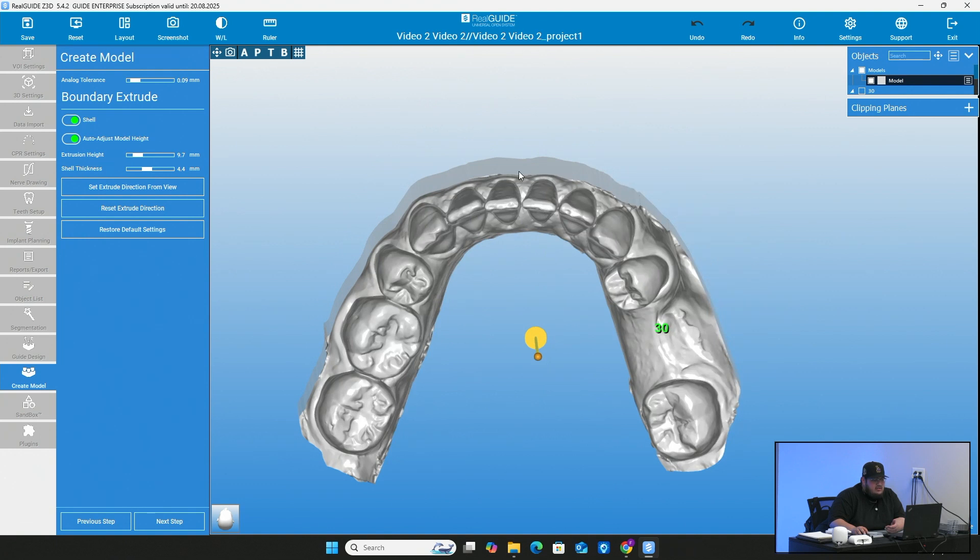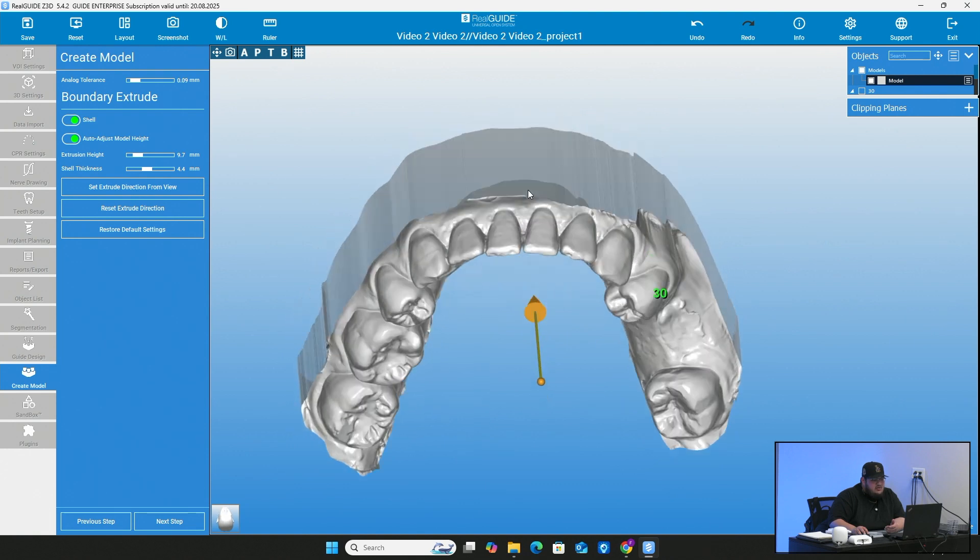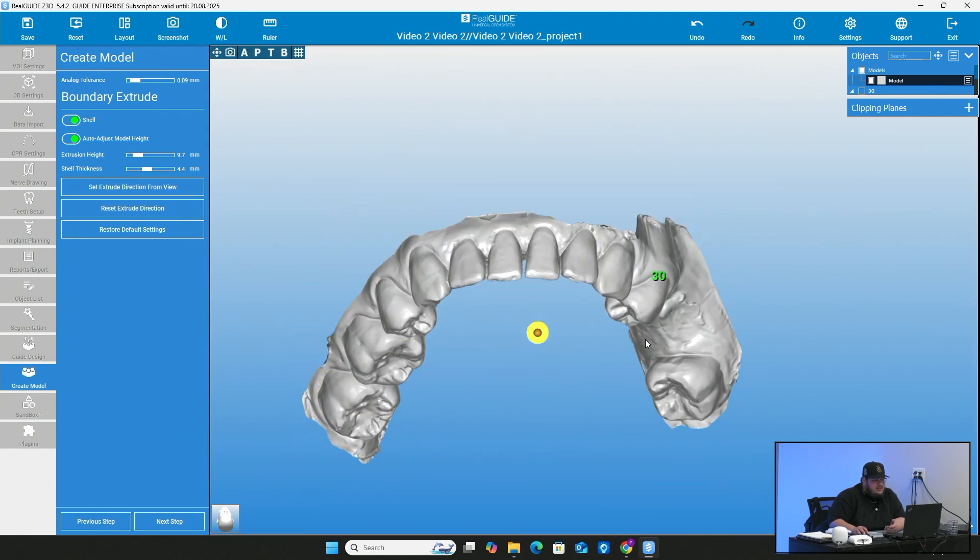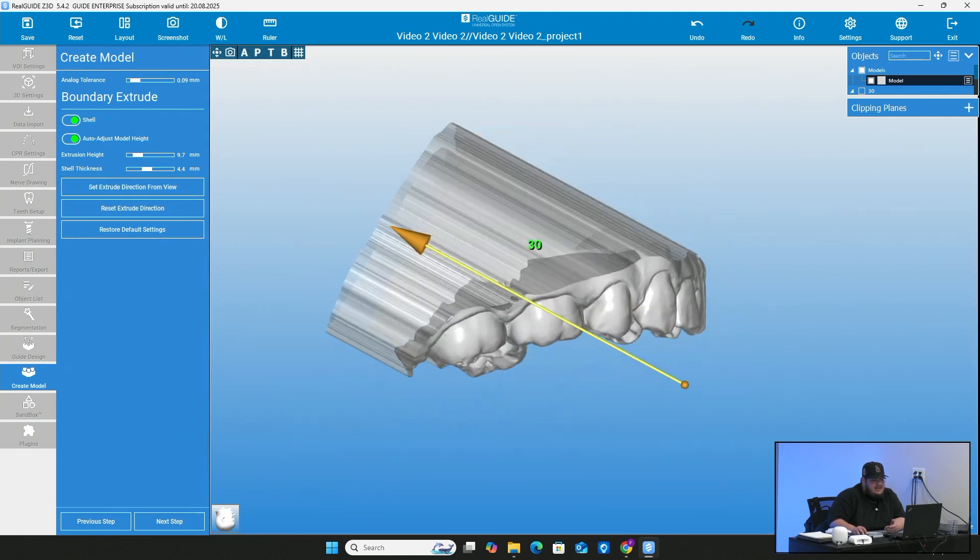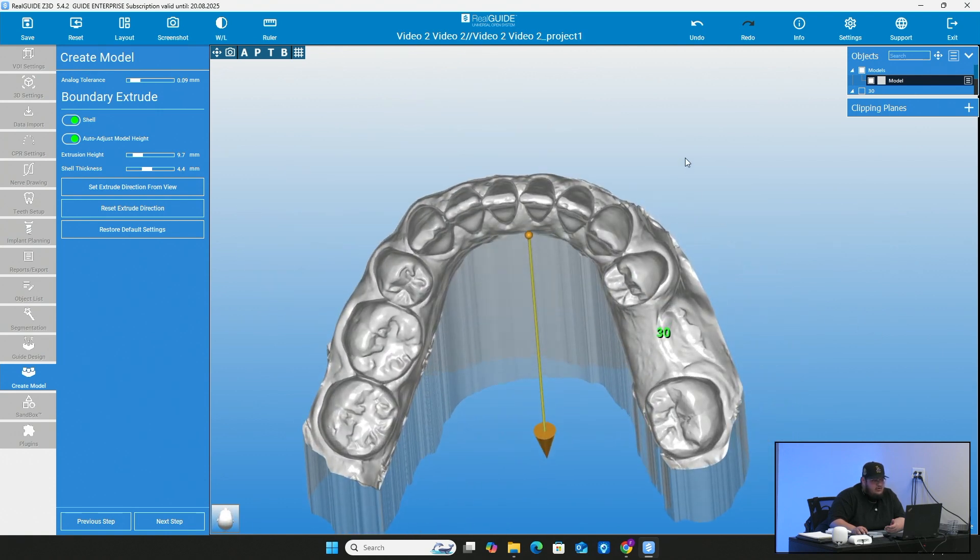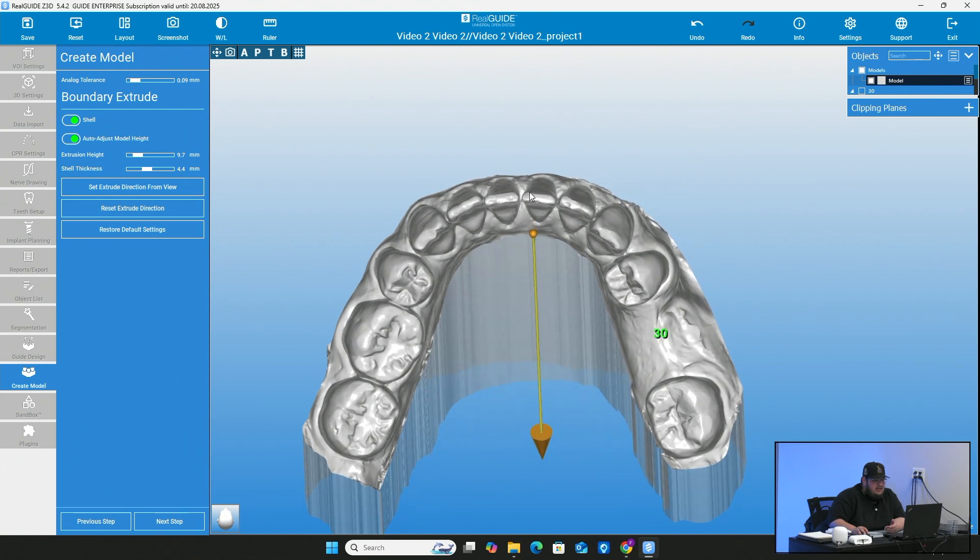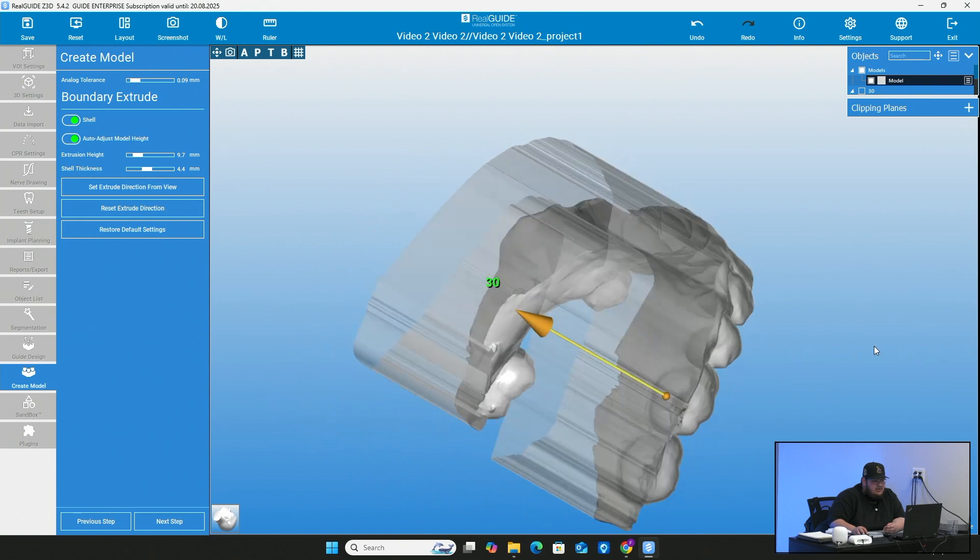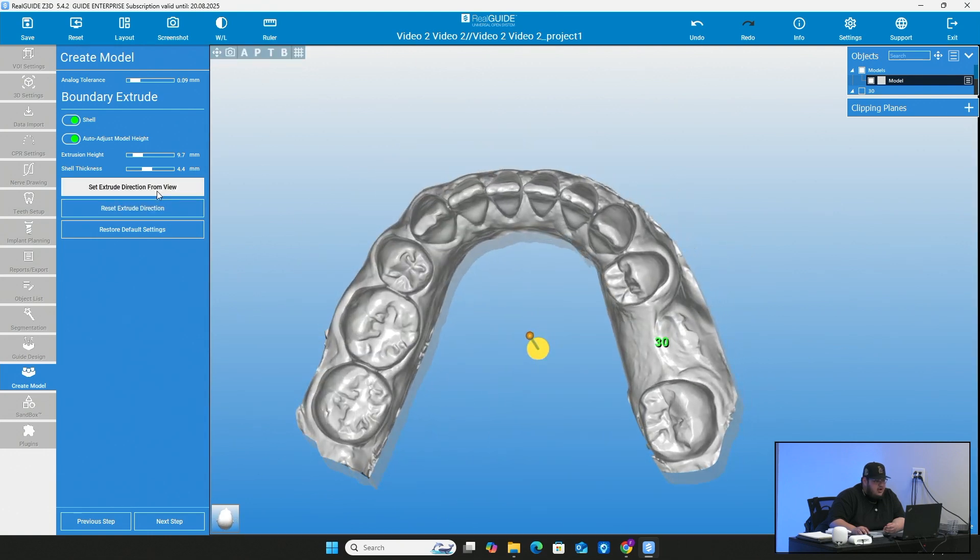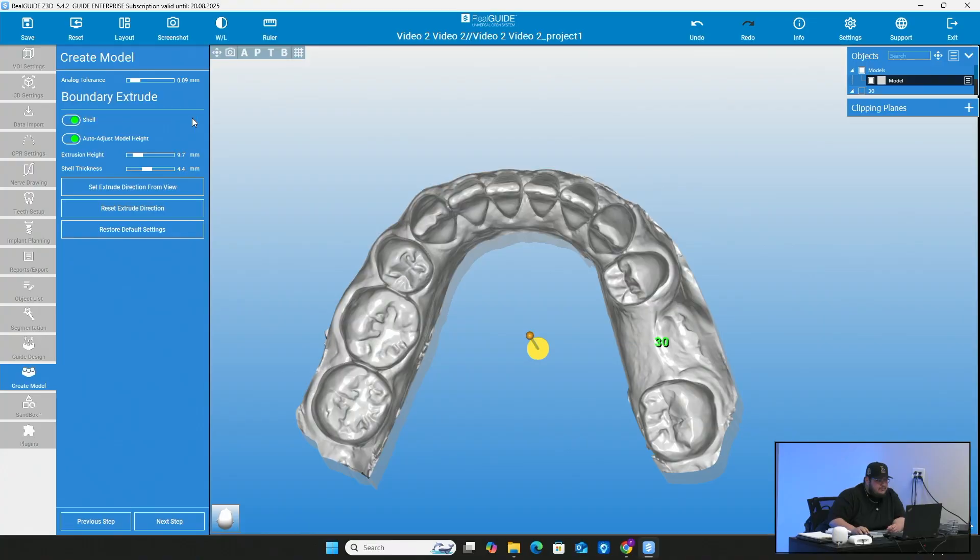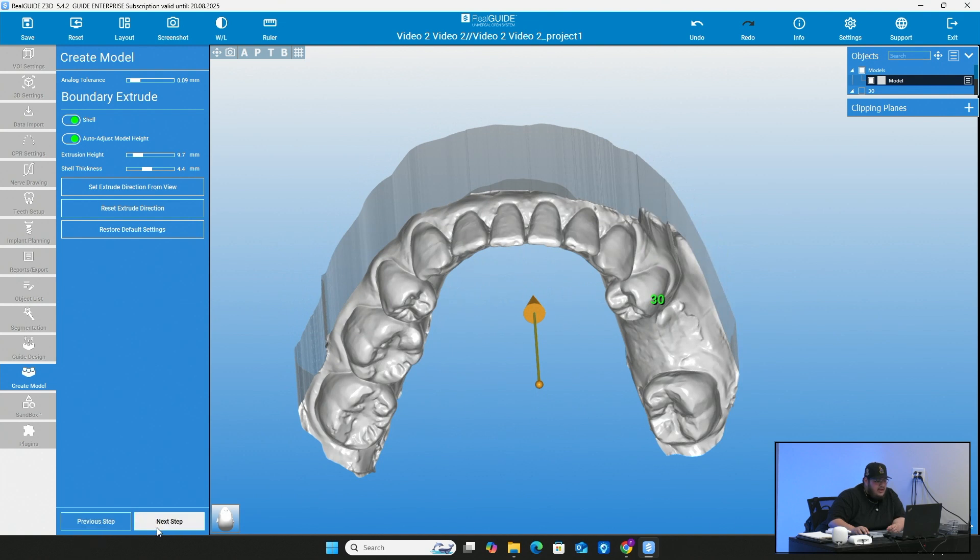And then of course, kind of how you're looking at this from the top view, you can see how far this base extends. If you go ahead and put set extrude direction from view, you can do that. So look at it from a perfect occlusal view, maybe a little bit forward looking at the facial of the teeth, and it'll make it kind of go straight up and down. That's really what you want. You can reset it and you can restore the default settings. But once you have everything set to your liking, go ahead and press next.